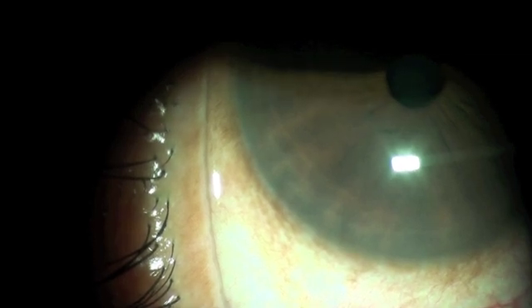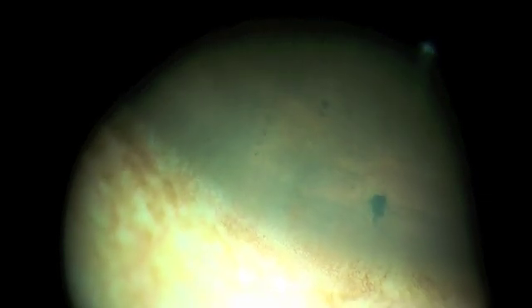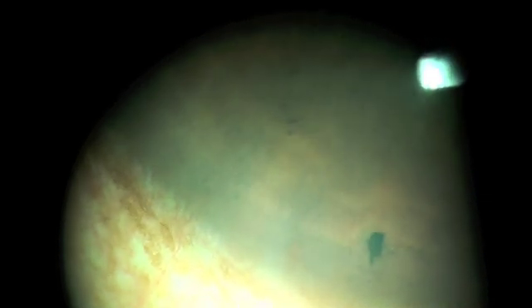We are using a power of 3.2 millijoules. After the first YAG shot, a small PI is created. Under higher magnification we can see the pigment and the aqueous from the posterior chamber floating into the anterior chamber.